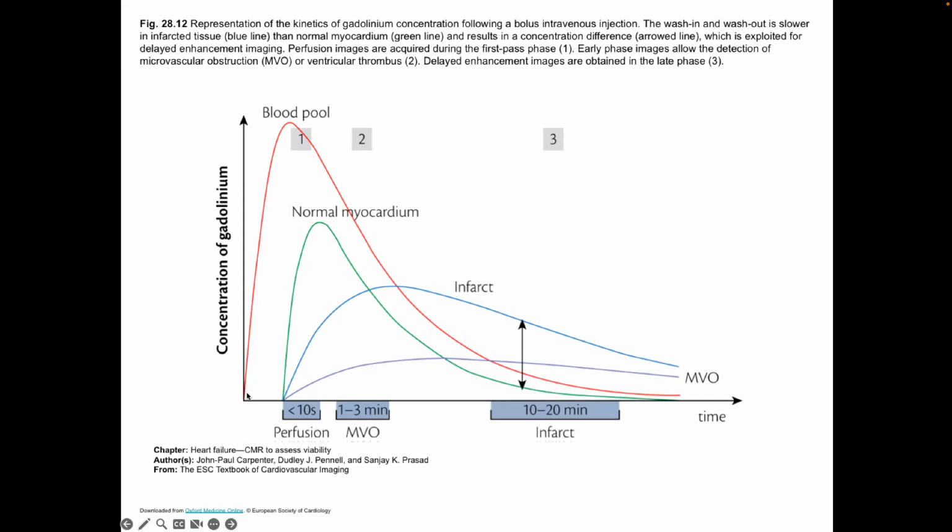So you can see as the concentration goes into the blood pool, the signal becomes very high on MR. And then as it's washing out and getting filtered out by the kidneys, it decays away. And the loss of this signal is truly the stuff getting shunted out of the kidneys and accumulating in the bladder. If you image the bladder, you would see it gets brighter over time like this.